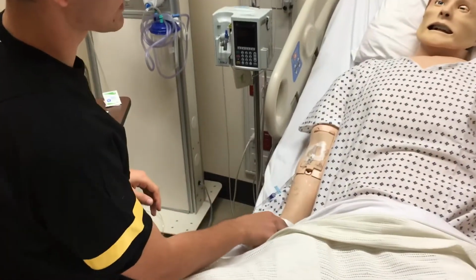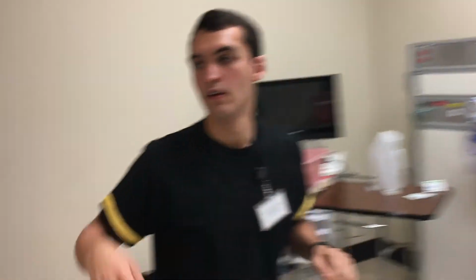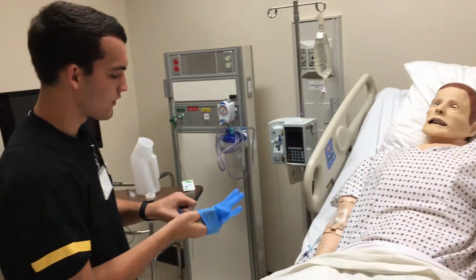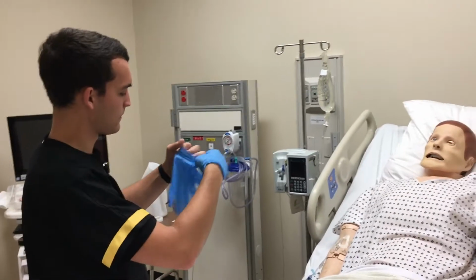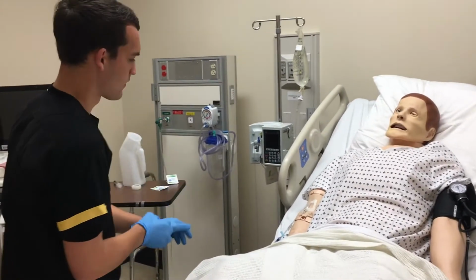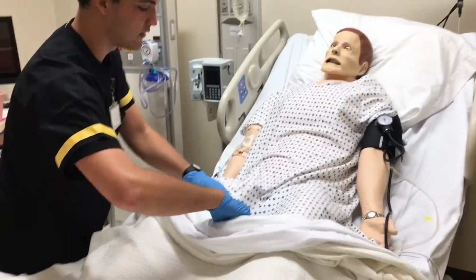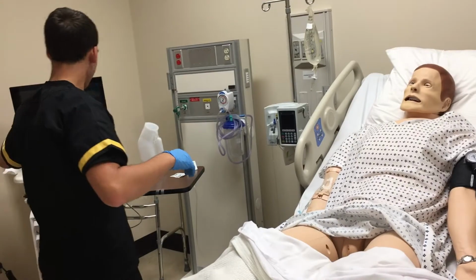Okay. Do you have any allergies to betadine or latex, iodine, shellfish? Okay, that's good you don't. So we can go ahead and get started here. So what I'm going to do first is pull these back a bit and wash your private area.